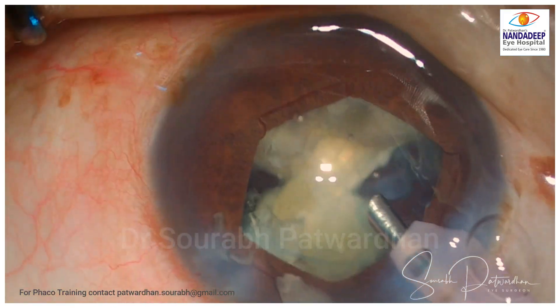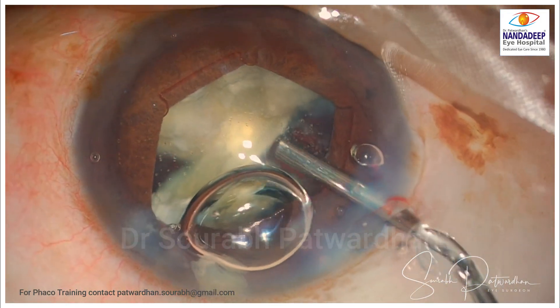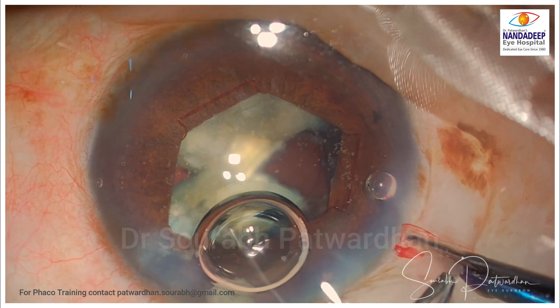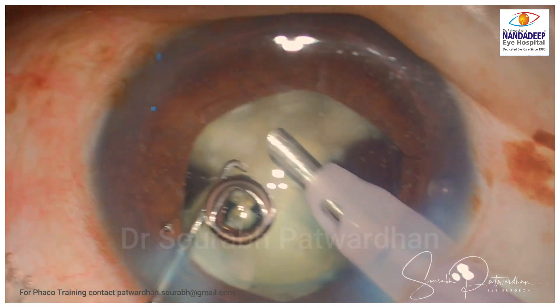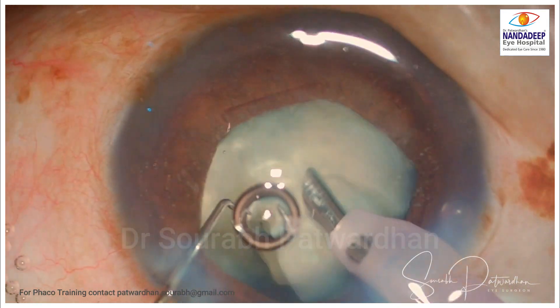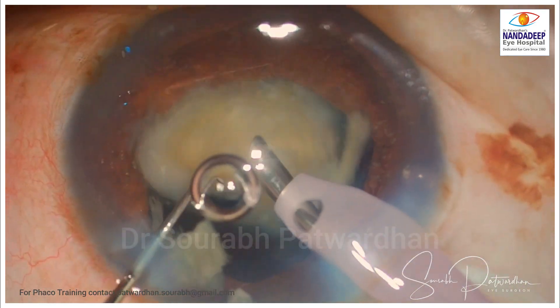Most importantly, in these cases where the shallow anterior chamber is present and the cataract is a bit mature, it is important to replenish the OVD. So I inject the Hilucote again followed by methyl cellulose in the bag. There is some conjunctiva ballooning, so I will make a nick in the Tenon's near the incision to avoid further ballooning. You can see a bubble in the Hilucote just near the endothelium — this will work like a sentinel bubble, indicating whether the Hilucote is coating the endothelium or not.